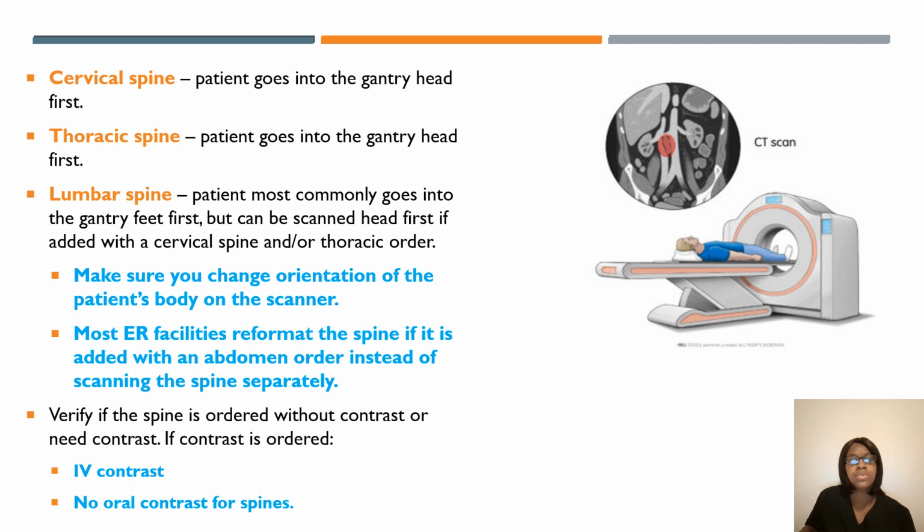So you also want to check and make sure that the order is with contrast or without contrast before you start and send the patient home. And most of the time, or I would say the majority of the time, you would not give oral contrast for spines. So you don't have to worry about giving oral contrast. For spines, it's going to be IV contrast.